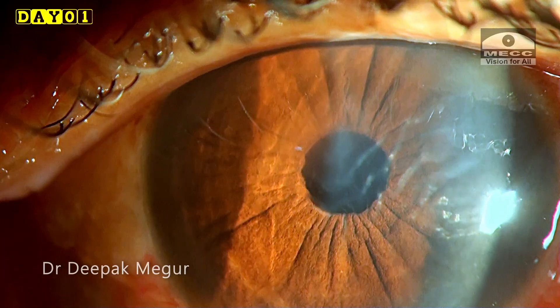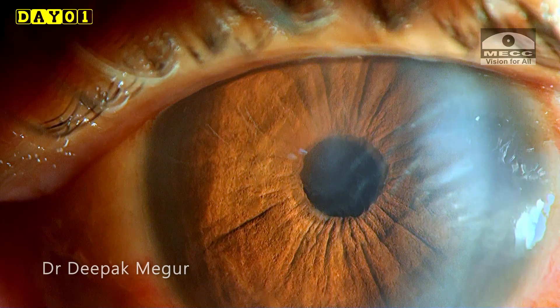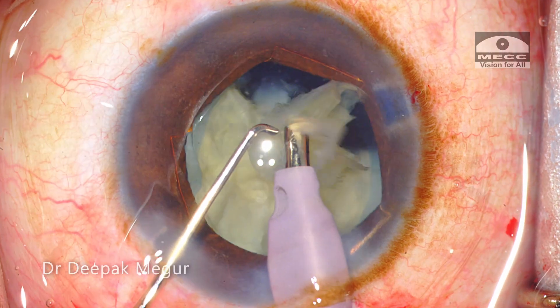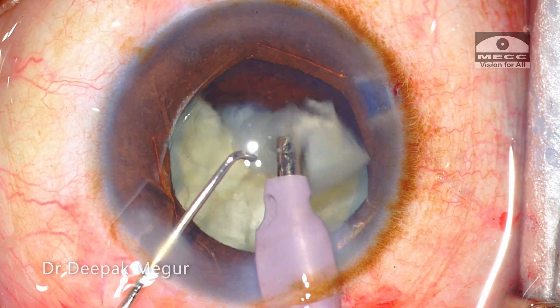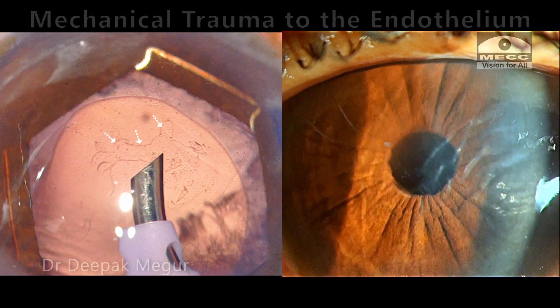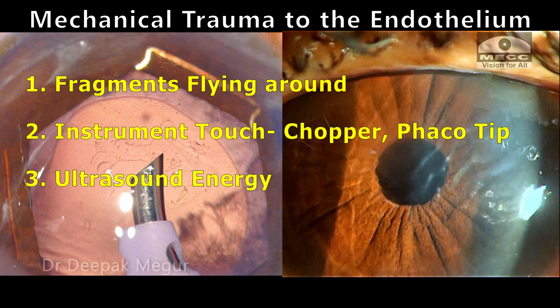The first post-op day: as expected, there are areas of localized corneal edema which clear off completely by the next week, and the patient was quite happy with the outcome. The lesson learned from this case is that the plane of emulsifying the nucleus is very critical. An anterior plane of emulsification — even if the nucleus is soft — can result in mechanical trauma to the endothelium, and we need to be aware of this.